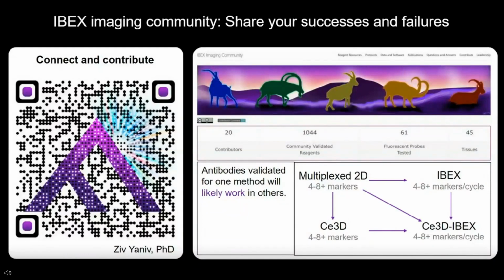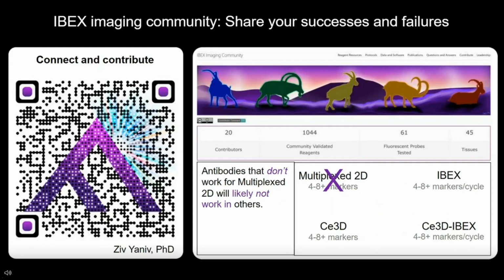And then finally the multiplex 2D, many of those target antibodies could work directly for C3D Ibex. However, antibodies that don't work for multiplex 2D, and that's really the stumbling block, will not likely work in others. So that's why we include all these methods, and also just to showcase the work in the spatial biology field. If you have any questions, you can get in contact with us.